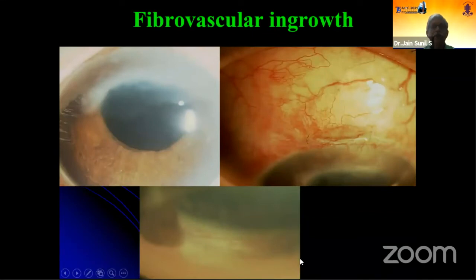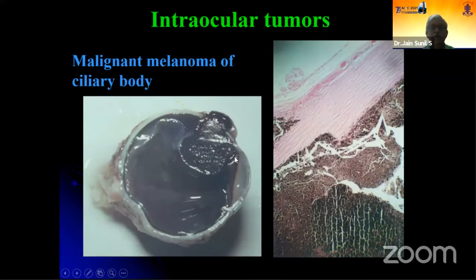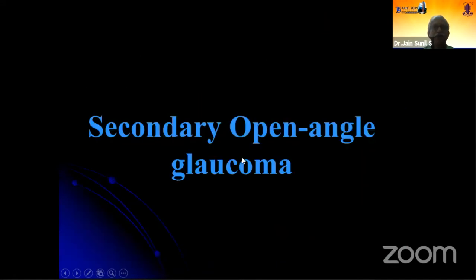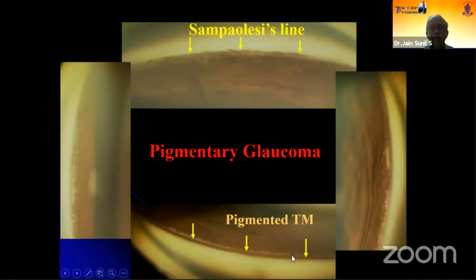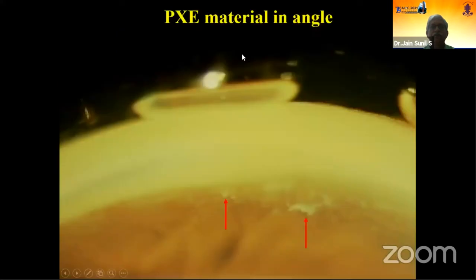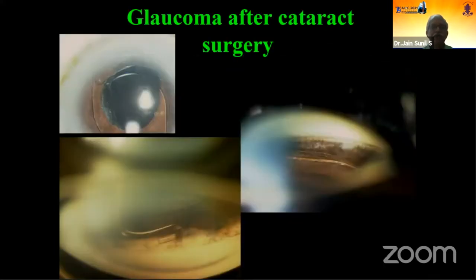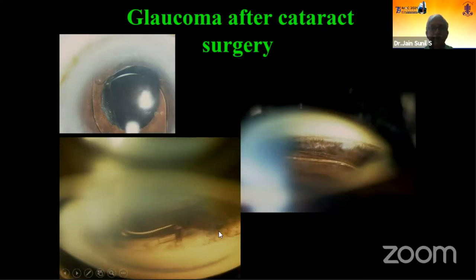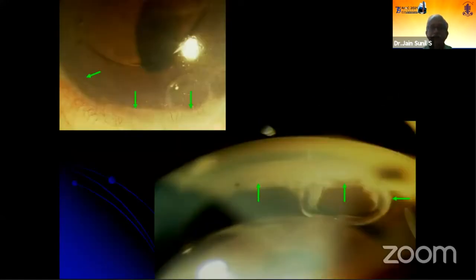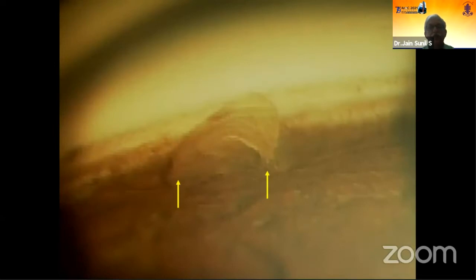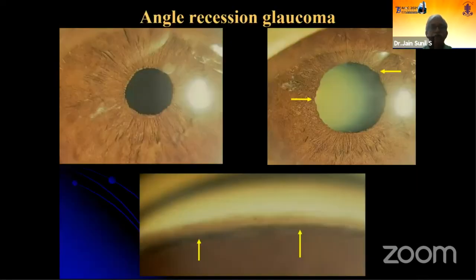This is how fibrovascular ingrowth would appear. Sometimes when a tumor of the ciliary body penetrates deeper into the angle structure, you might see it as a peripheral anterior synechiae. This is how pigmentary glaucoma would appear — you might see trabecular meshwork pigmentation with the Sampaolesi's line. Pseudo-exfoliation in the angle structures can also be seen. Post-cataract surgery, vitreous loss can cause increased pigmentation and inflammation of the trabecular meshwork. Old-generation anterior chamber lenses could cause complete synechial angle closure. Post-phaco, if an epinucleus piece is left behind, that could cause intermittent uveitis and glaucoma. This is how angle recession glaucoma would appear.